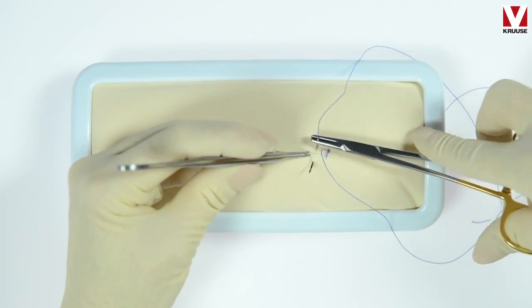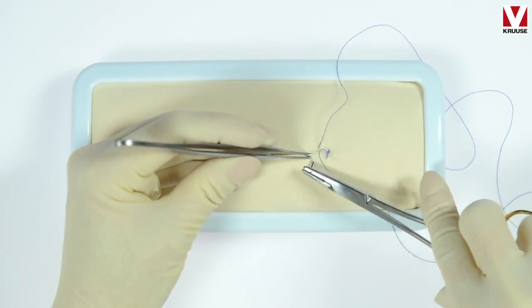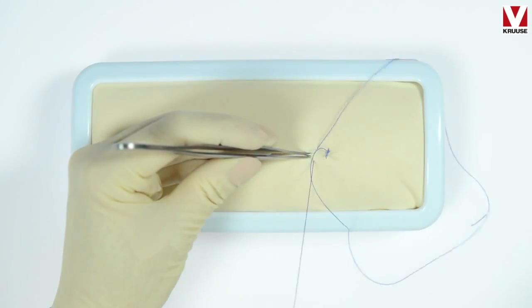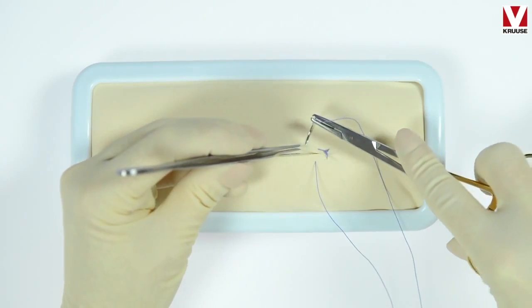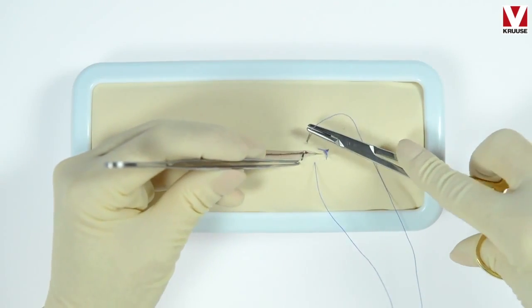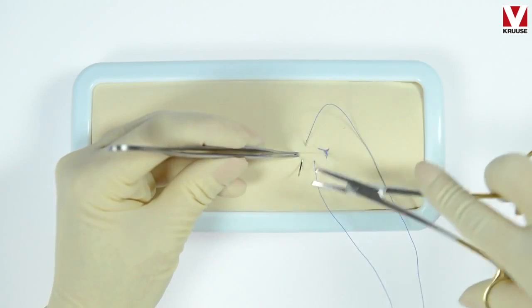So you go from one side to another. Try to make each bite equally in size, and make sure that you have the same distance between the stitches.